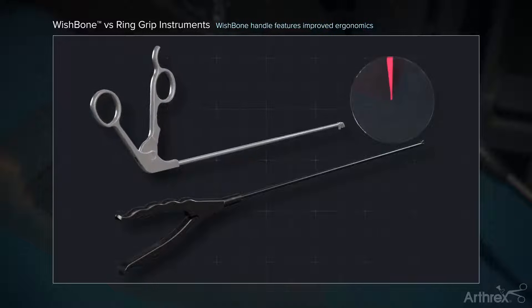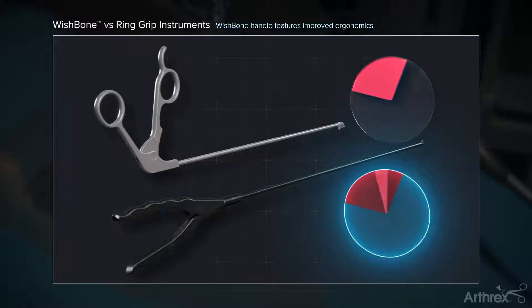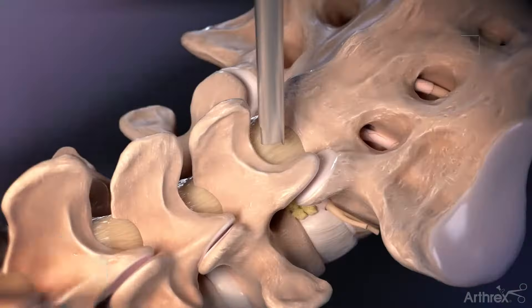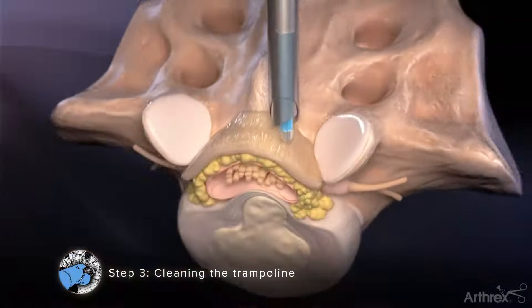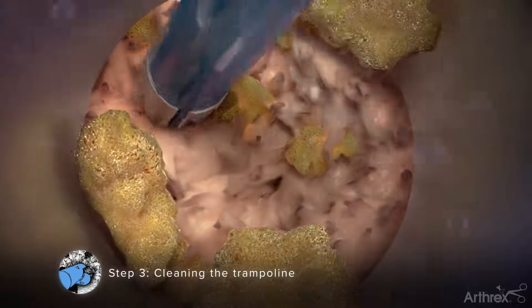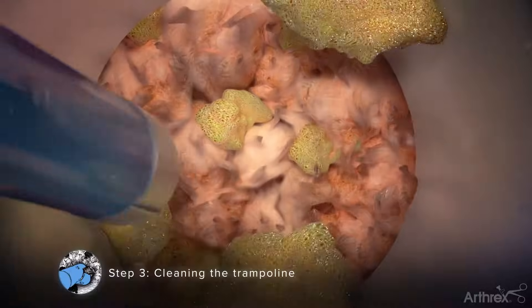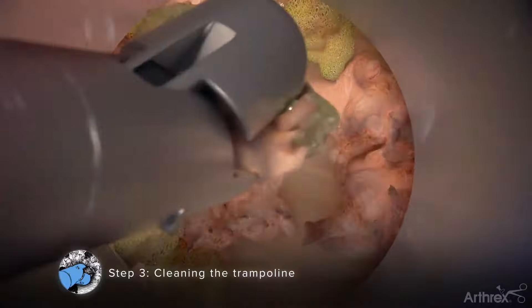Arthric offers a unique wishbone handle design that allows for improved ergonomics and mobility of the instrument by the surgeon. Step 3: Cleaning the Trampoline. Once the endoscope has been inserted, insert a series of grasping instruments and the electrosurgery probe through the working channel of the endoscope to remove excess tissue and coagulate blood vessels to expose the ligamentum flavum.